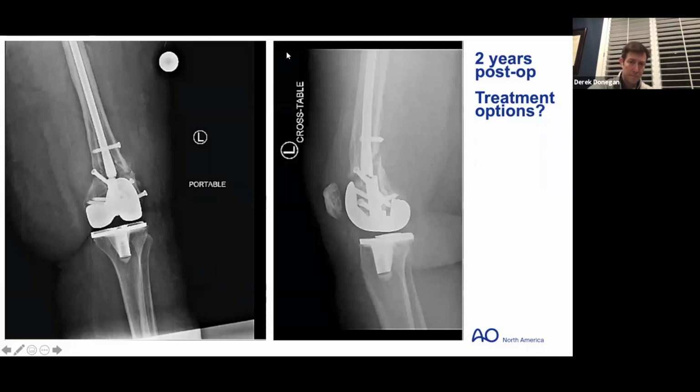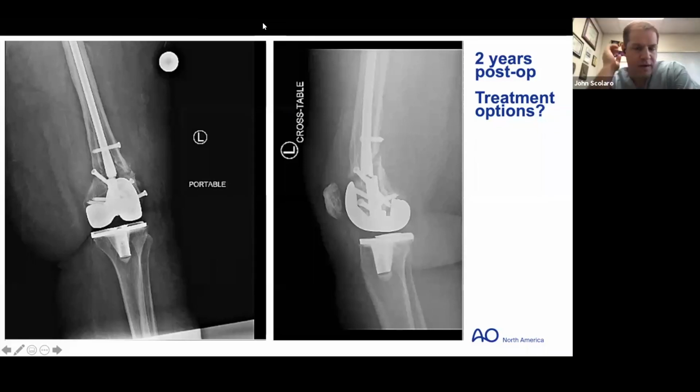Yeah, I was thinking blade. I think you have enough opportunity for compression here. And if you really needed to, you could do something on the medial side, but take it down. You could even optimize the surface area in which you're going to compress, and then squeeze it. The reason I was asking about function is because you either revise and go to the non-union, or you're thinking about a distal femur replacement.